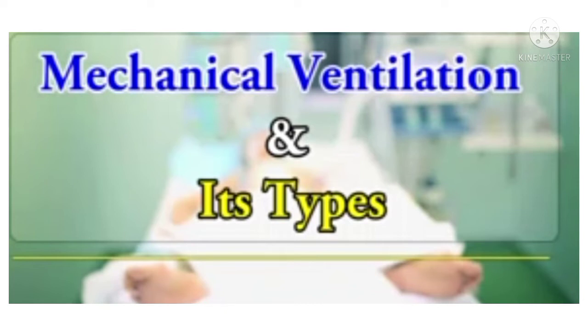Positive pressure ventilation, PPV, is the primary method used with acutely ill patients. During inspiration, the ventilator pushes air into the lungs under positive pressure. Unlike spontaneous ventilation, intrathoracic pressure is raised during lung inflation rather than lowered.